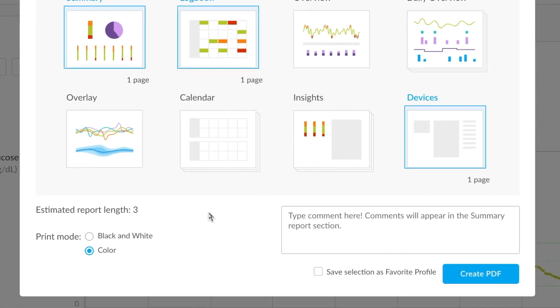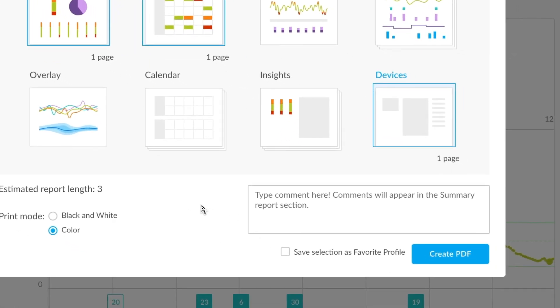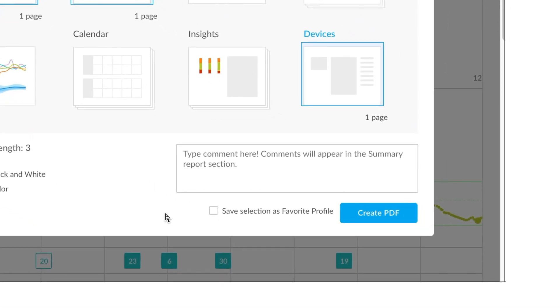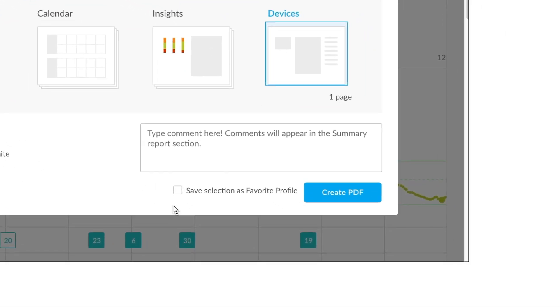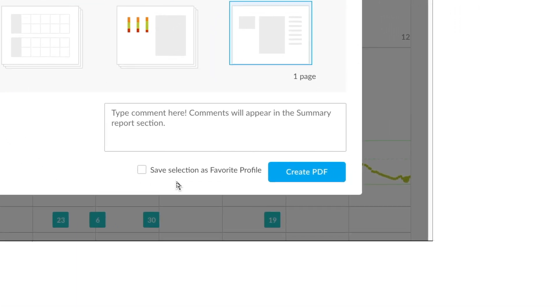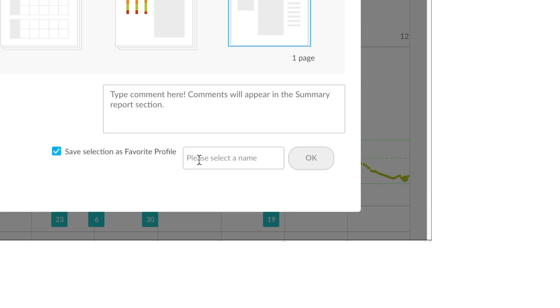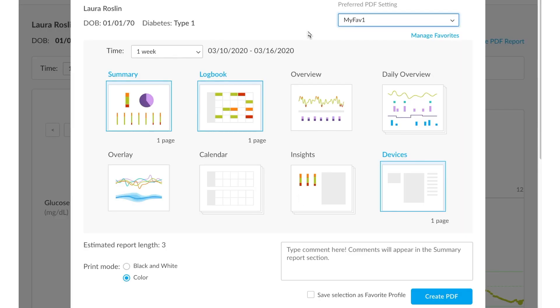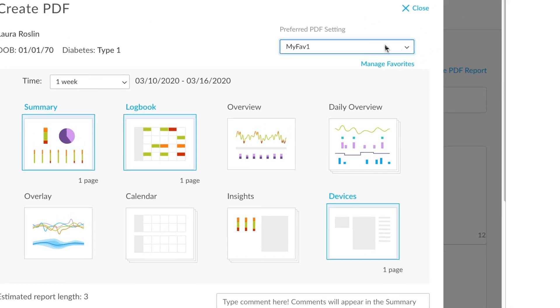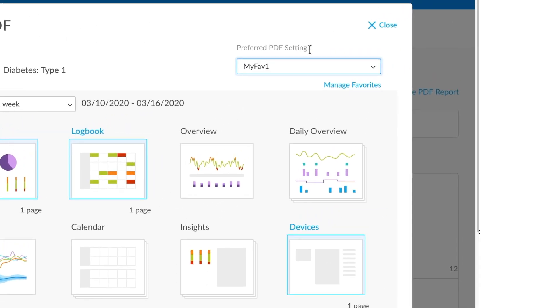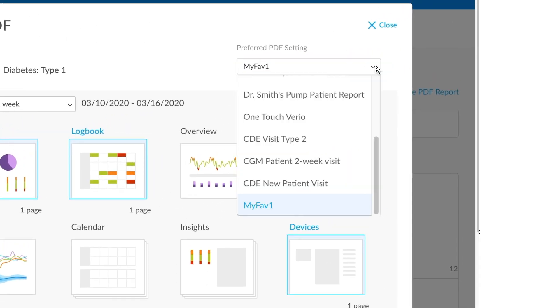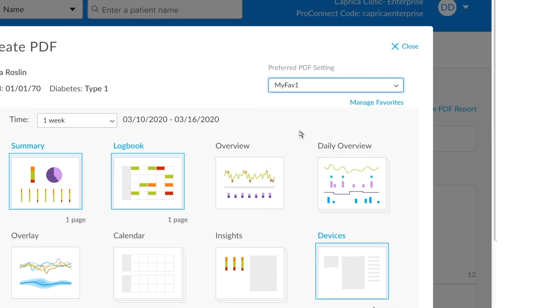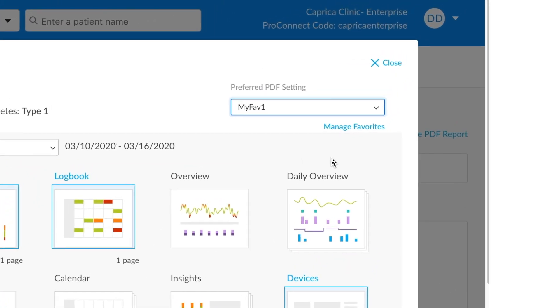One great feature of this Create PDF option is you can save your favorite profiles. Moving down to the Save Selection as Favorite Profile option allows you to save it as a name. Let's call it MyFave1. Pushing OK will save this as my favorite profile. You'll see that this profile is now saved up in my preferred PDF settings option here. If we ever needed to select these options again, just use it from the drop-down.